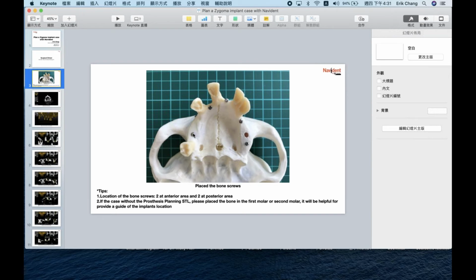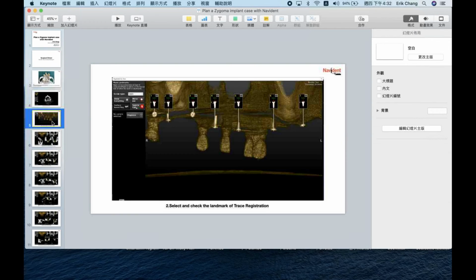Yes, but these are not zygomatic implants. Maybe the anterior ones are straight implants, while the posterior are zygomatic. You mean if the anterior is a zygomatic? No, posterior. Yeah. Zygomatic posterior, anterior straight. Yes. Okay. Good.